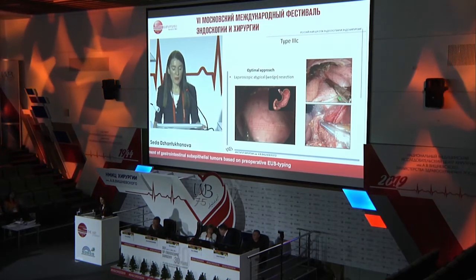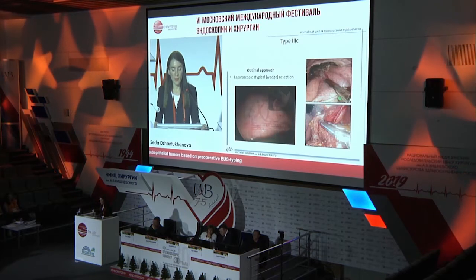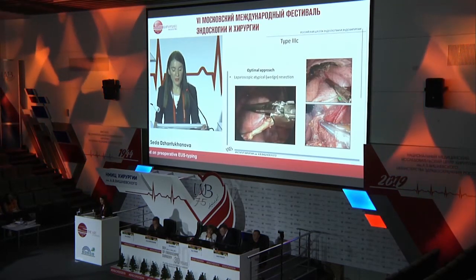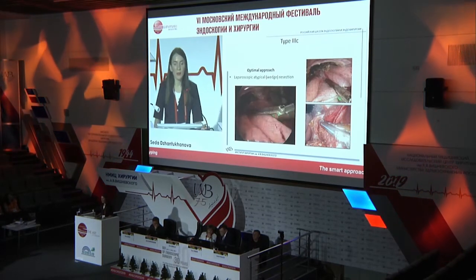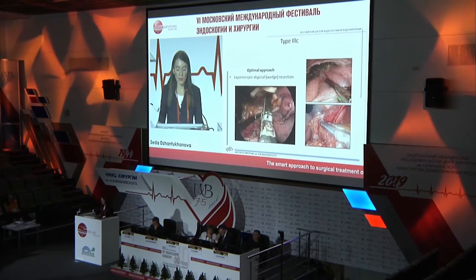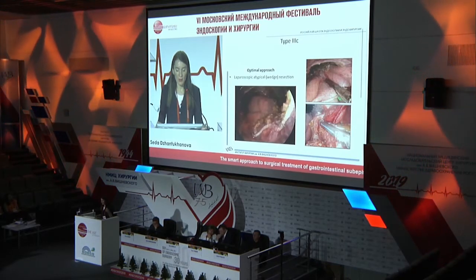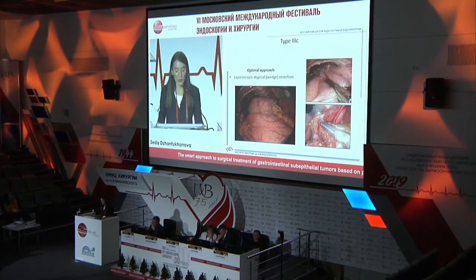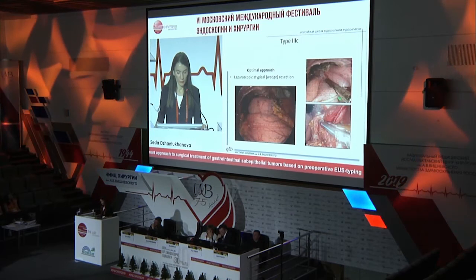For example, in this patient, the tumor was located in the fundus, as you can see on the scheme. We performed a laparoscopic resection using the endoscopic stapler technique, as you can see on this video. A tumor located in the fundus is really easy to remove very fast using staplers, and there's no risk for any problems here because we have a normal gastric wall and no anatomically narrow spaces.